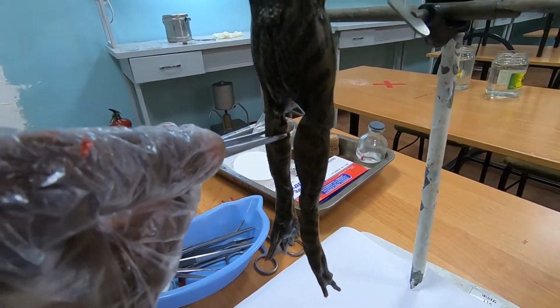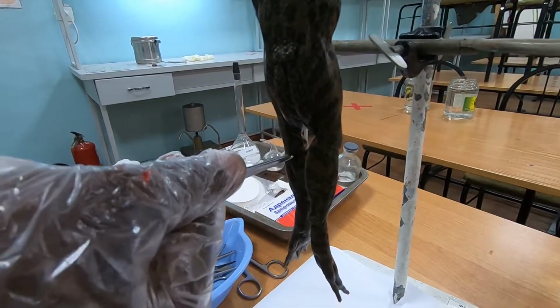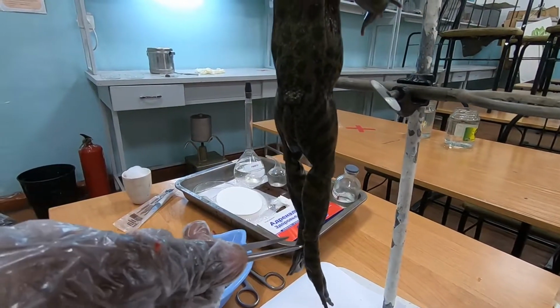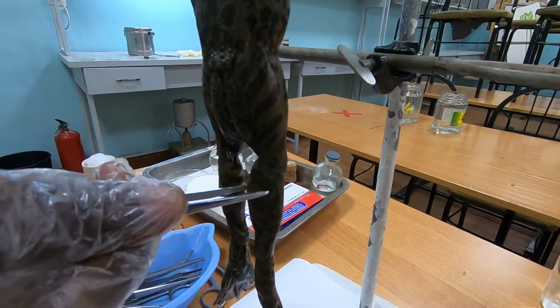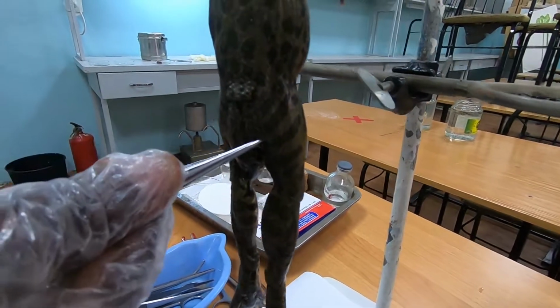Okay, let's try the muscles. It happened just a little. The frog is still in a shocking condition, shocking phase.